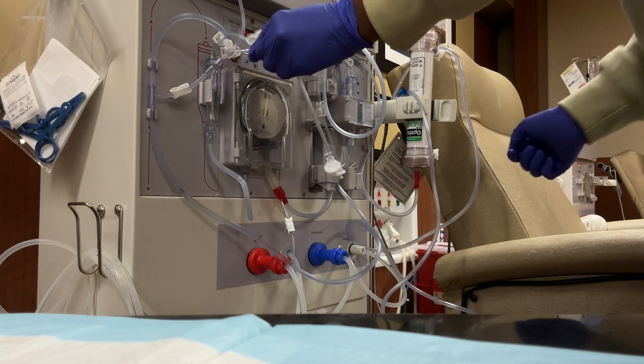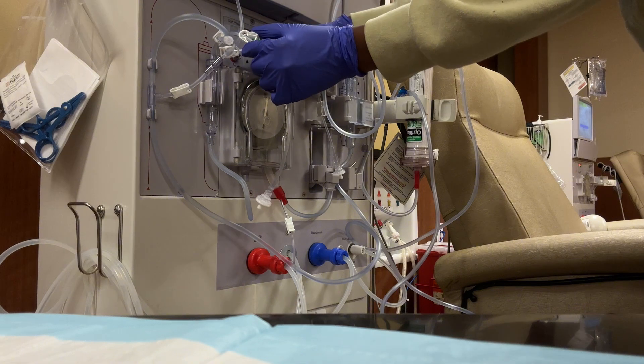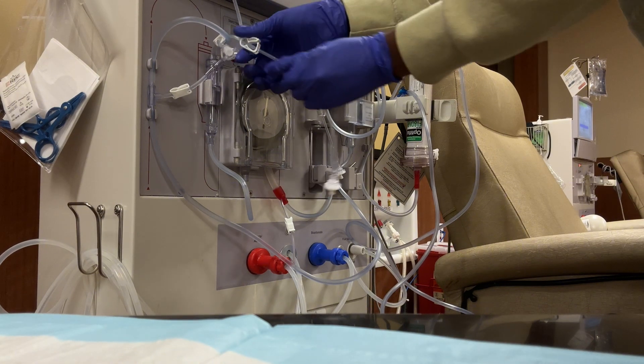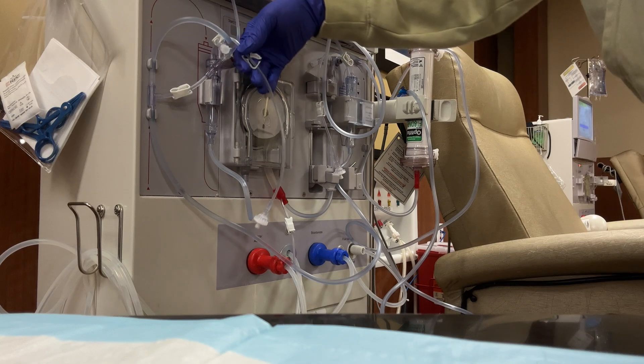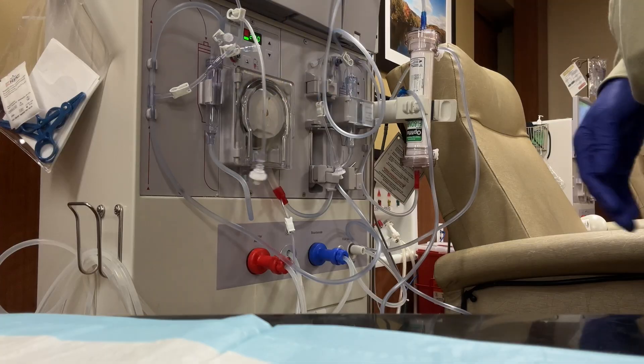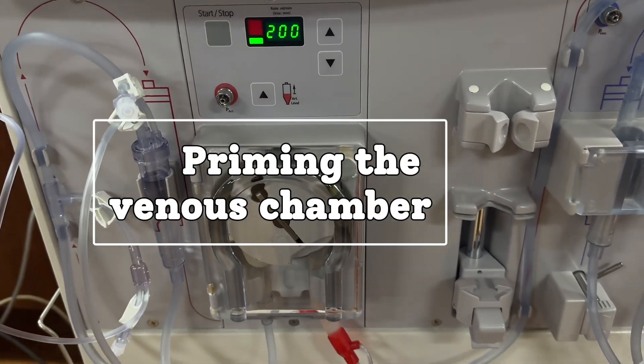So here I am filling my arterial chamber with the line that has a transducer on it. If you forget to clamp this off, you will get water in your transducer and you don't want that. So be careful. Clamp. Clamp. Clamp.